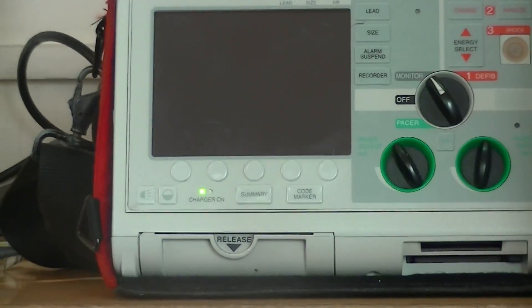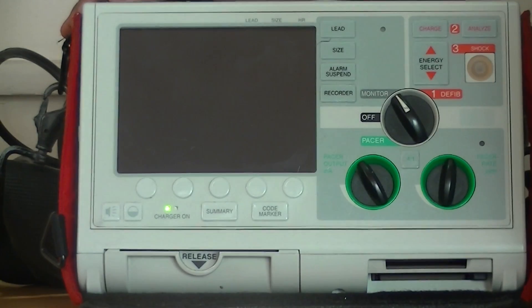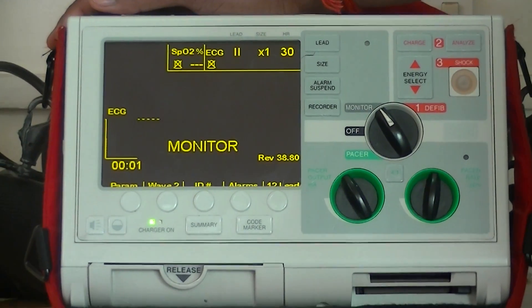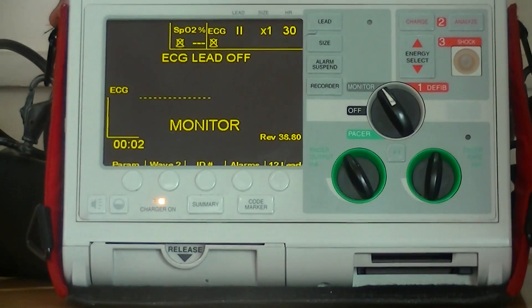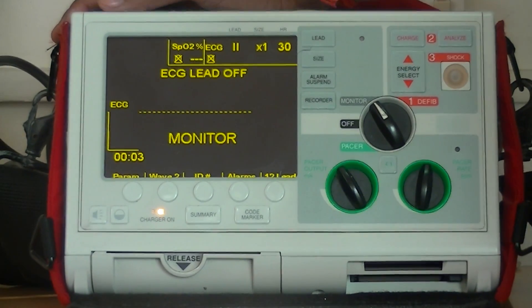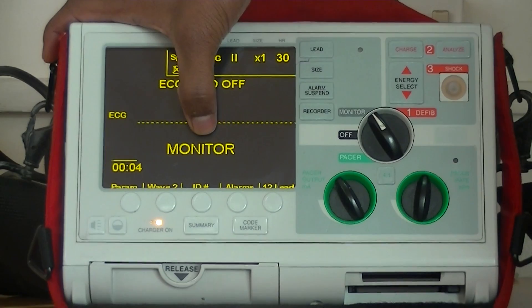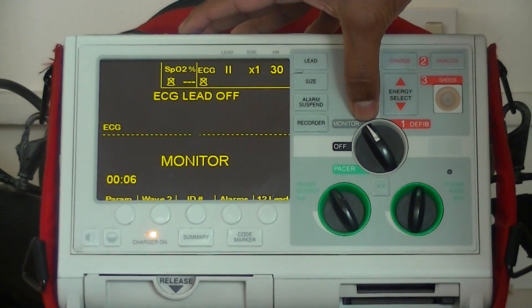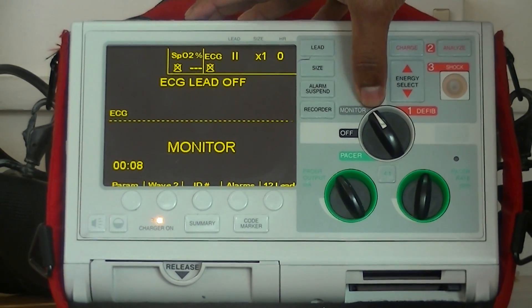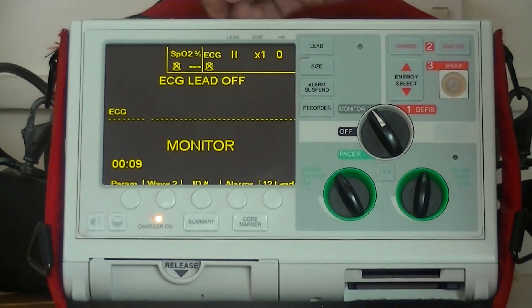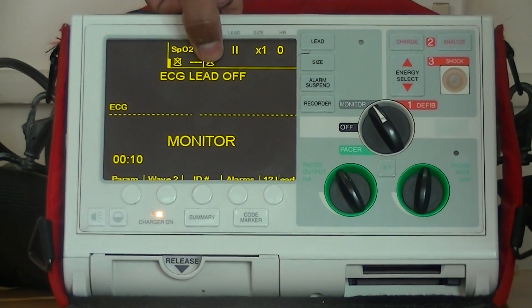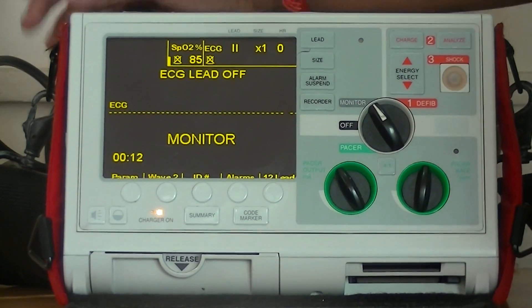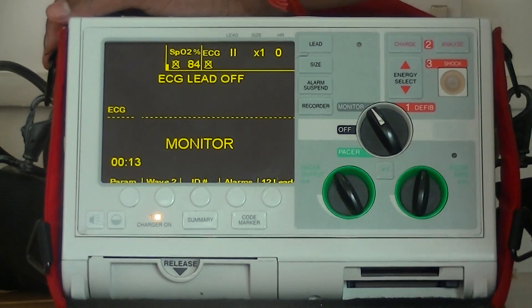I am going to switch this on. Once it is switched on, it will start with 4 beep sounds, which indicates it is in monitor mode because we put the screen monitor in the monitor mode. You can see the ECG shows leads off because we did not connect this to the patient.